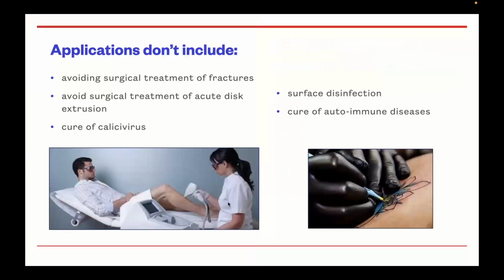Now, although laser therapy is versatile, there are limitations to its spectrum of action. The applications of laser therapy do not include avoiding surgical treatment for fractures. You still need to go into the OR with the fractures. With the acute disc extrusions, it happens the same. Laser therapy is going to help with gingivitis, but it's not going to cure the calicivirus.